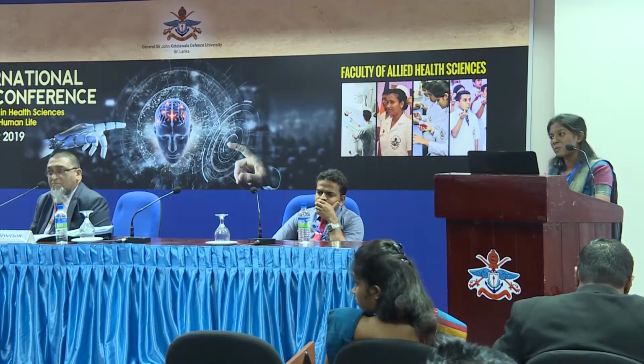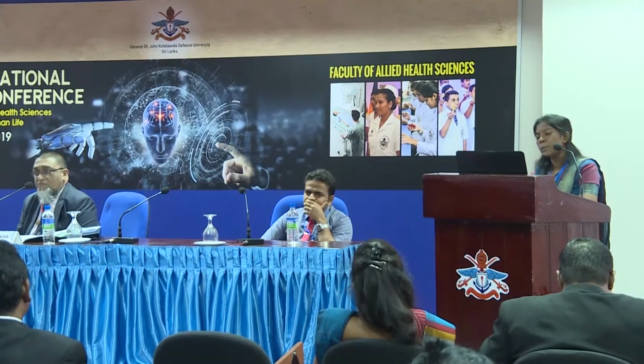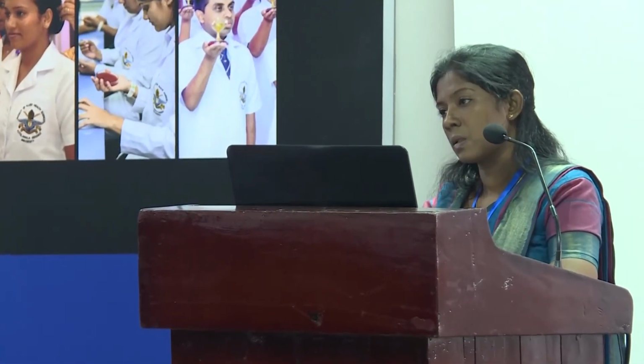Roughly how many milliliters of serum do you require for your test? To prepare one concentration of sample, I needed 2 ml of the serum. So you said you took 5 milliliters of that, right? Was it for this study as well as for several other things, or only for this? No, I did the bilirubin interference also, but in this presentation I am only presenting the urea interference. Okay, thanks.